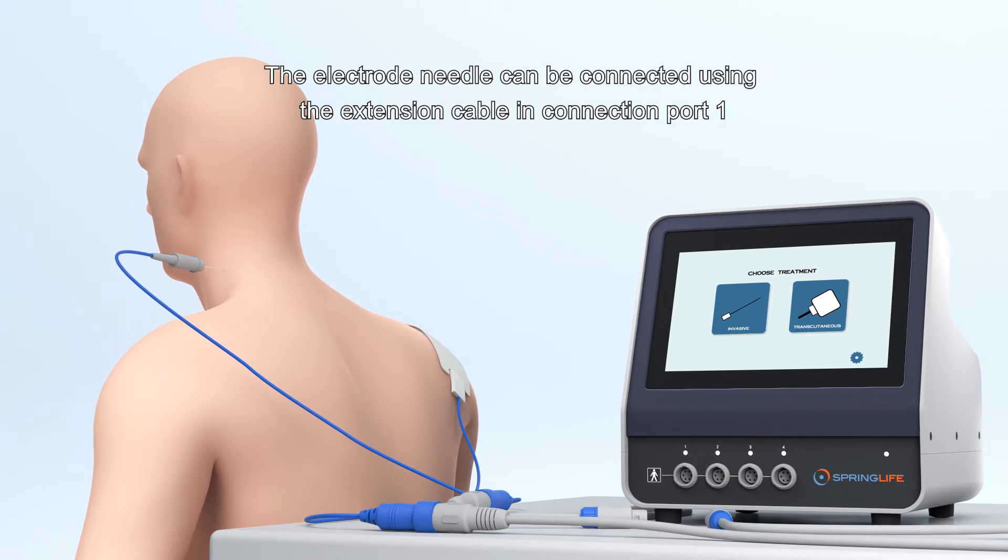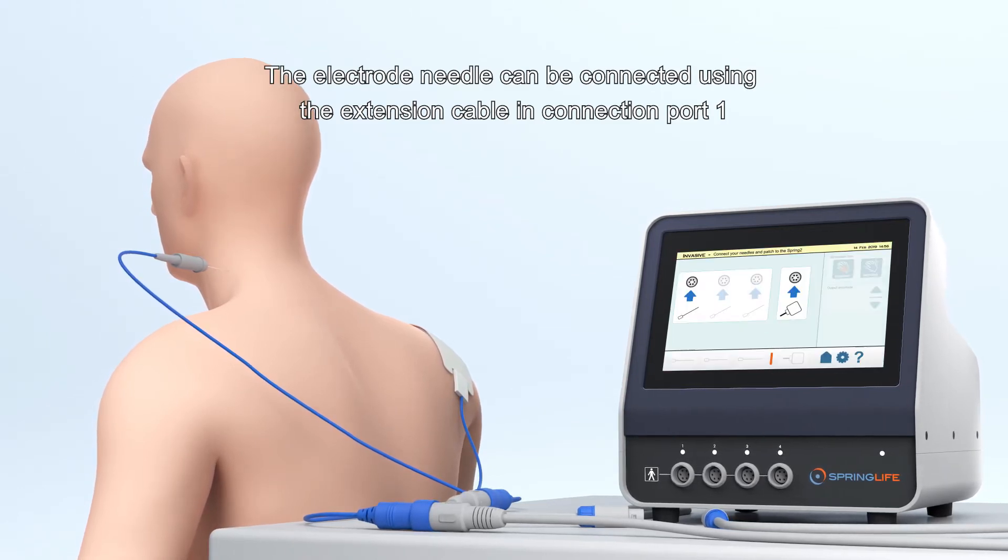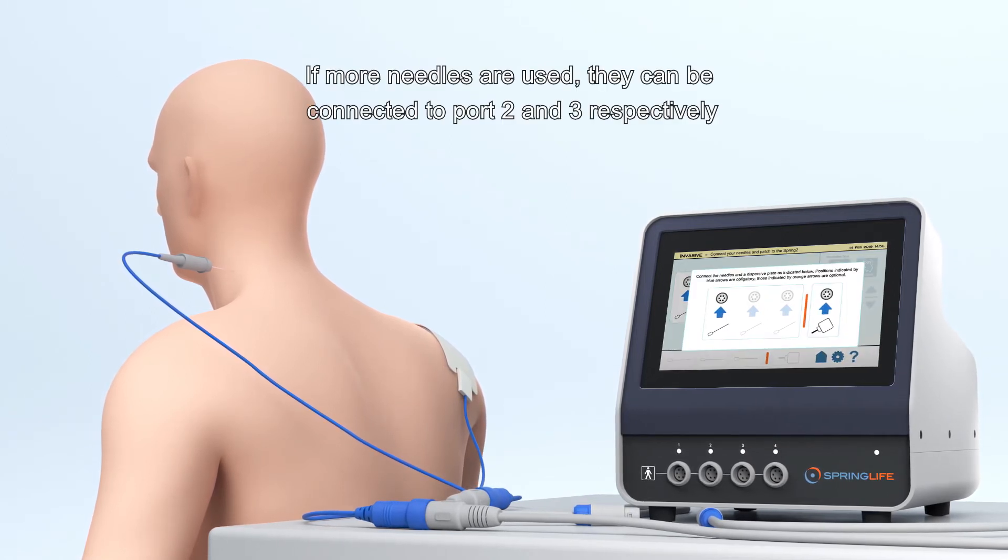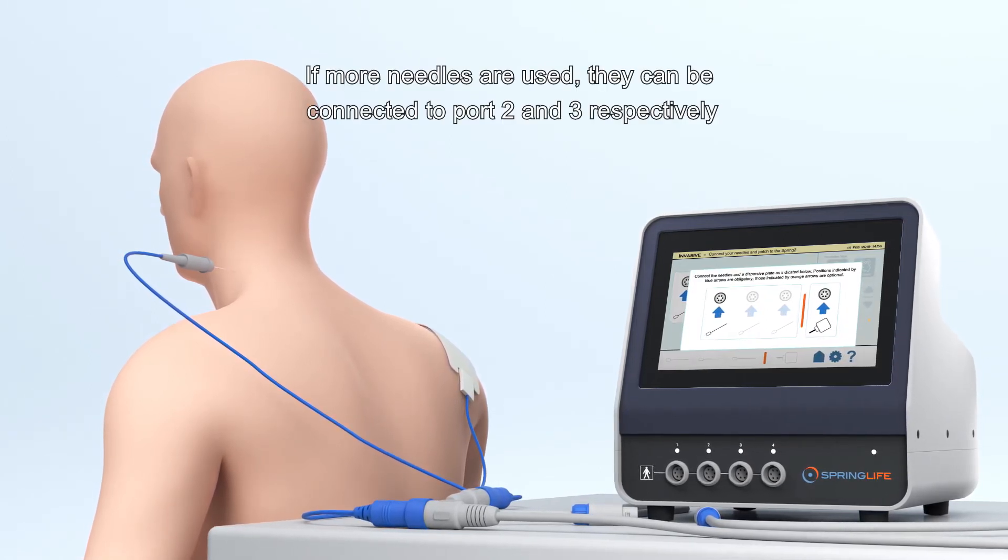The electrode needle can be connected using the extension cable in connection port 1. If more needles are used, they can be connected to port 2 and 3, respectively.